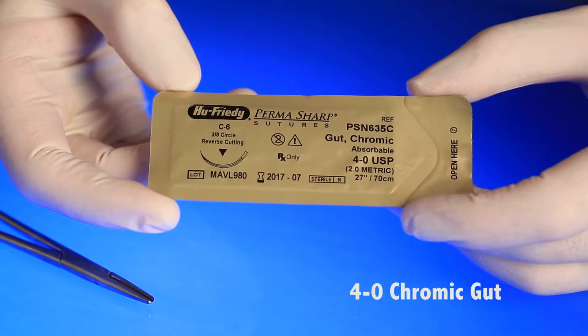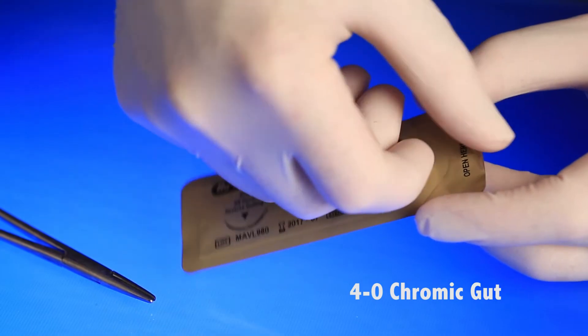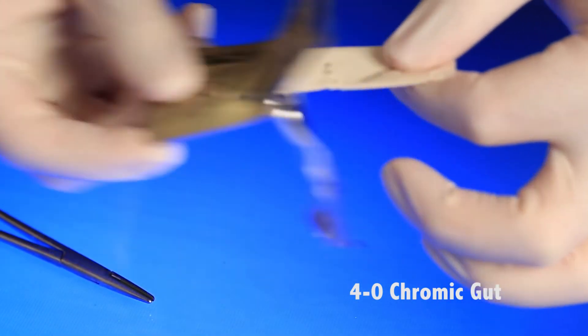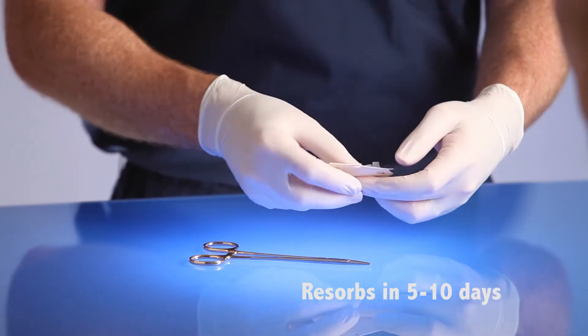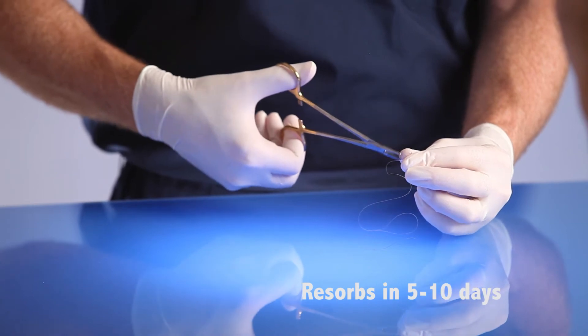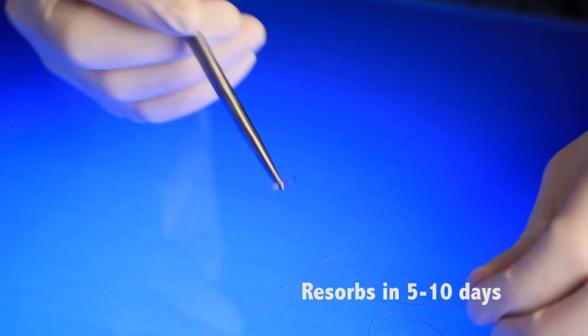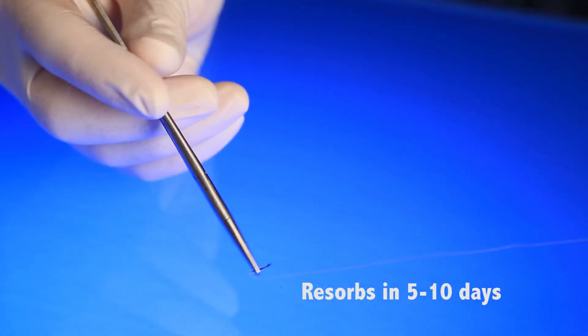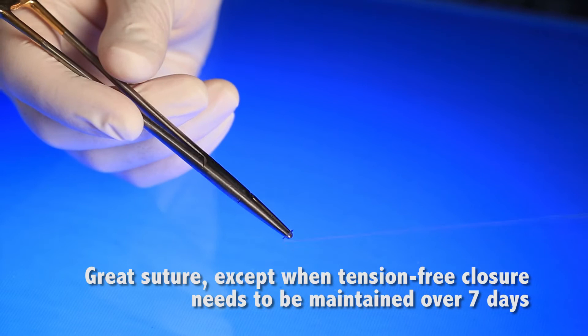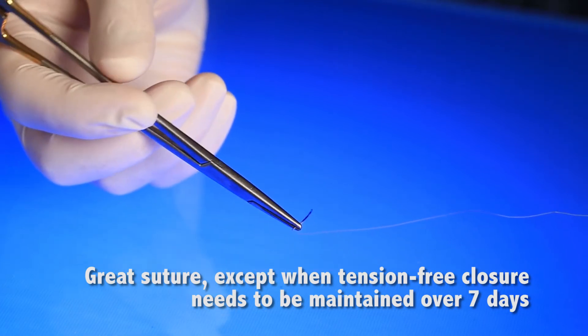4-0 Chromic gut is also a great all-around suture. Chromic refers to chromic salt compounds that are added to gut suture to retard resorption until five to seven days. Use it for implant surgery, extraction socket suturing, third molars, etc. Because chromic gut resorbs in five to ten days, it is best for surgeries where there is no need for constant tension. I don't recommend 4-0 Chromic for ridge augmentation because tension-free closure can be compromised by a suture that starts to loosen after the fifth day.